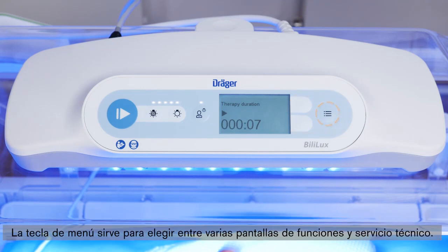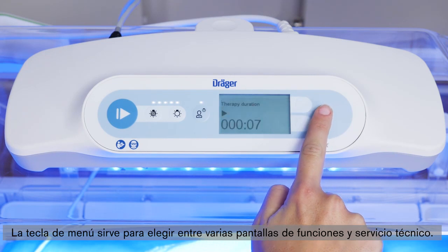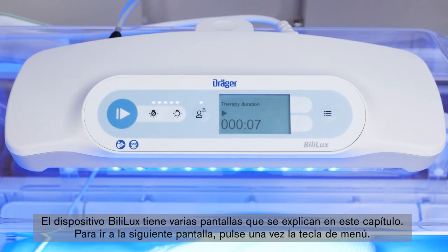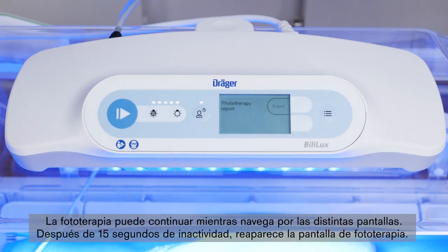The menu key is used to select among various operational and service screens. These two buttons have several functions that are not defined on the currently selected screen. Phototherapy can continue while you navigate among different screens. After 15 seconds of inactivity, the display reverts to the phototherapy screen.